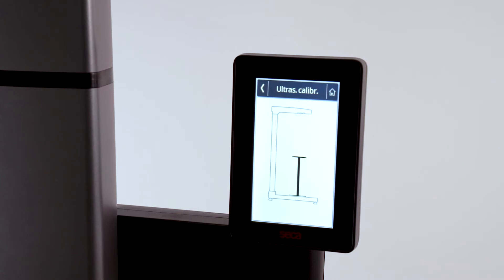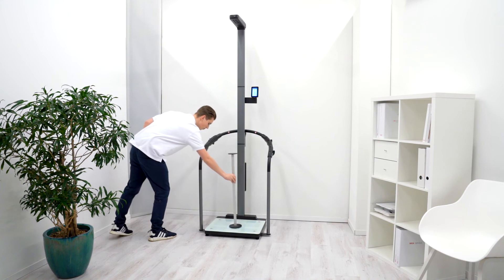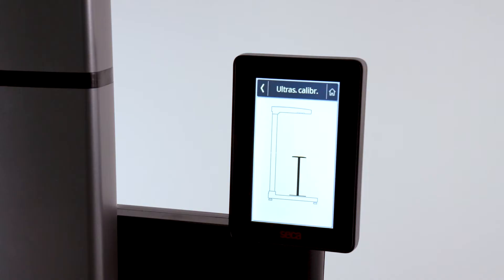After the measurement is complete, center the calibration rod on the platform and wait until the second calibration measurement is complete.